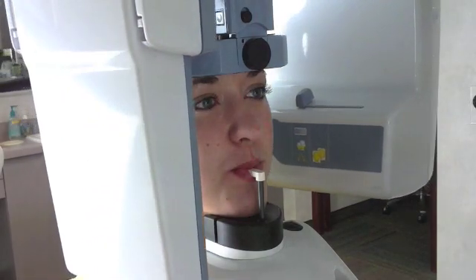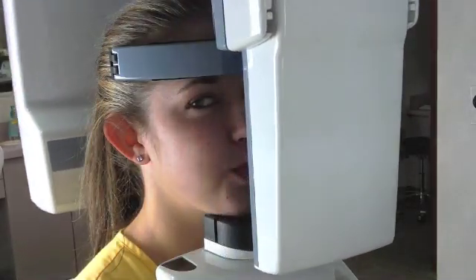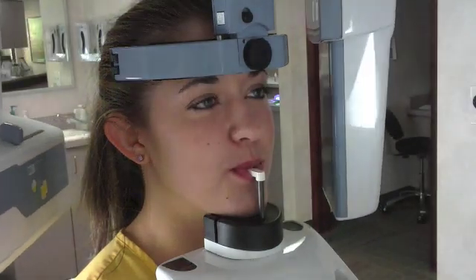The digital panoramic x-ray is going to rotate around the head. It takes about 12 seconds to complete. The patient just has to stay nice and still until it is complete.